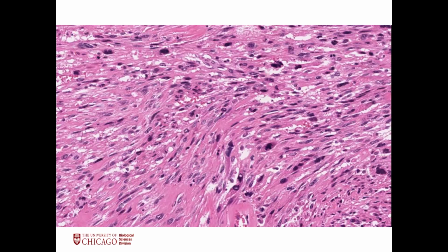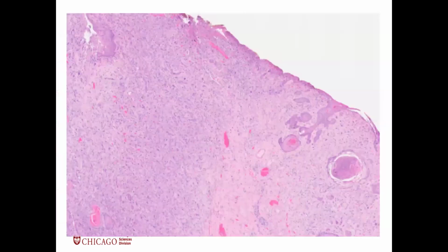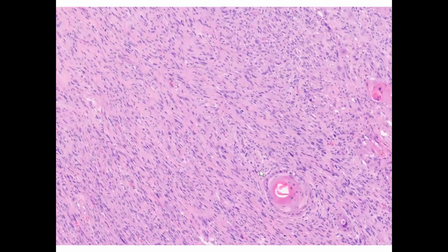Well, yes, the presence of atypical mitotic figures, hyperchromasia, things like that. Another thing that can help you is if you have at least a little bit of squamous dysplasia or carcinoma in situ in the overlying epithelium, or if you have some squamous component mixed with your spindle cells. Now look at these spindle cells. They don't look so scary. They don't look so bizarre, atypical, or mitotically active. But this is still a spindle cell squamous cell carcinoma.